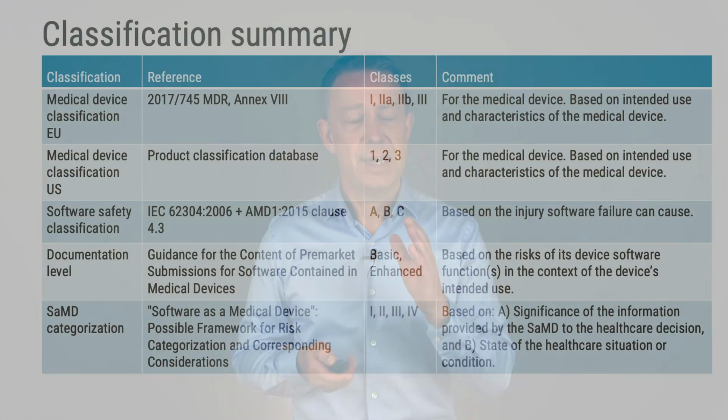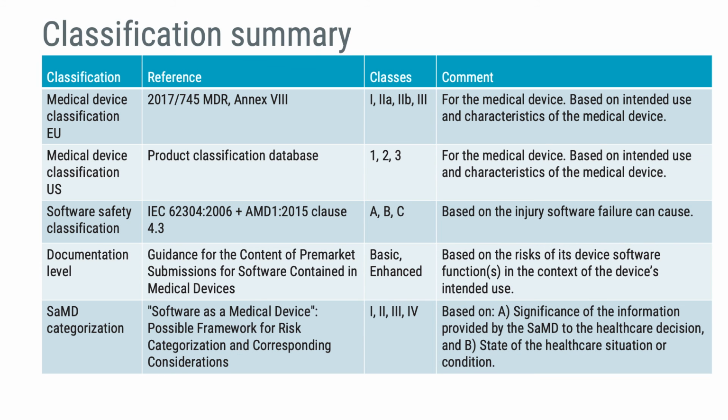You've now learned about four different classification concepts related to medical device software. If you are a software engineer, especially in a large company, you will probably have people helping you out with these things. Still, if you are in a small company, you can most certainly get involved in software safety classification or have to actually do it yourself. In case you get involved in classification work, here is the summary of the classification we have just gone through. You will also find this table in the text below. And that's all in this video about classification.